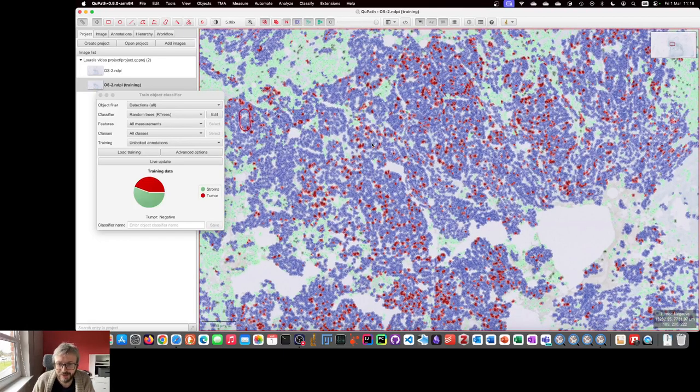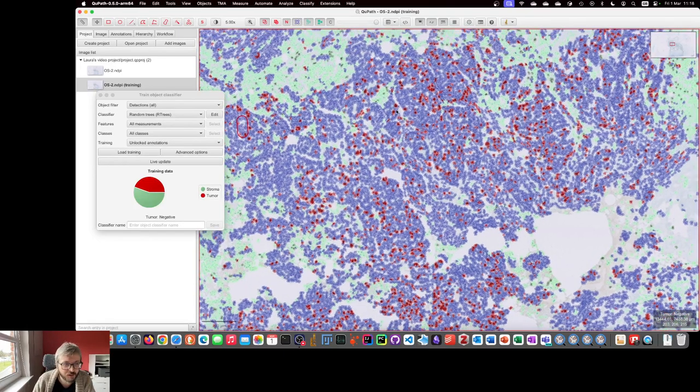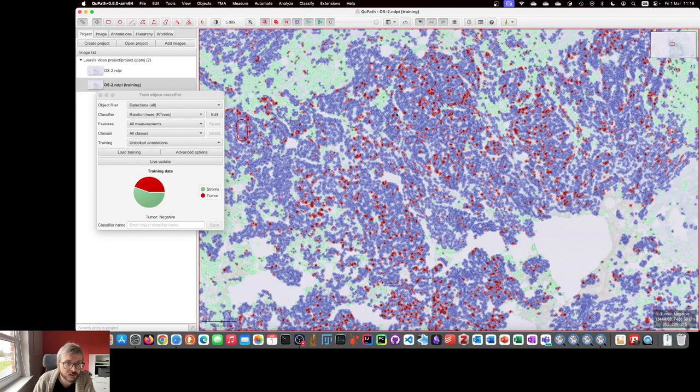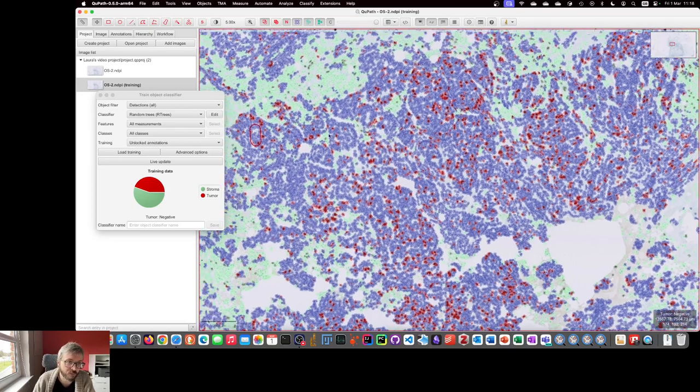Hey Laura, Pete again. In this response video I want to talk a little bit about why we have this annoying behavior in QPath that when you're setting the intensity classification you can't interact with the image.